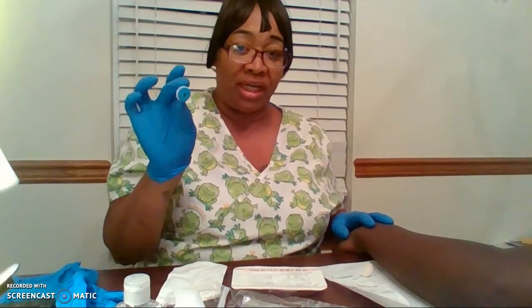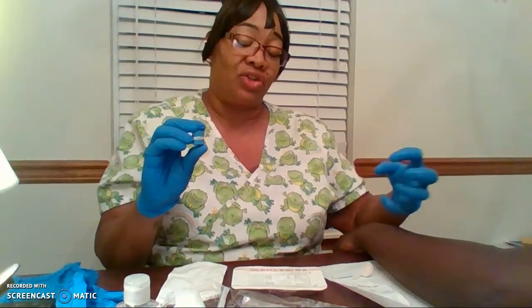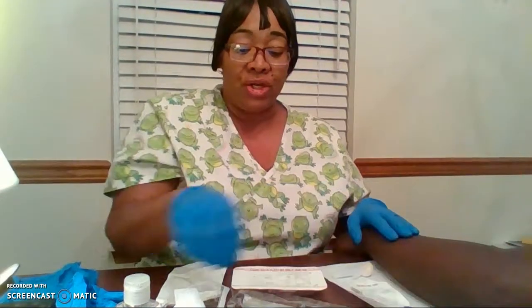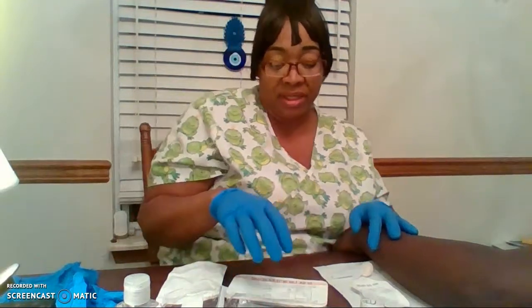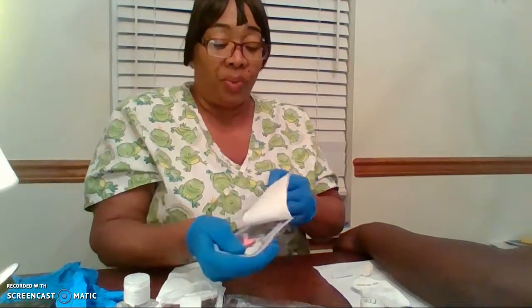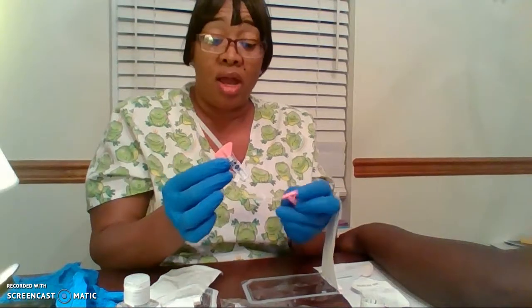You're going to apply a tourniquet, and if you apply it too tight, then you will collapse the veins and decrease the amount of blood that's flowing to the intended IV site, and you'll find that the veins are flatter and harder to access. You will need some tape to secure the line once you attach it, and there's usually some additional gauze in there in case there is a little bit of spillage.